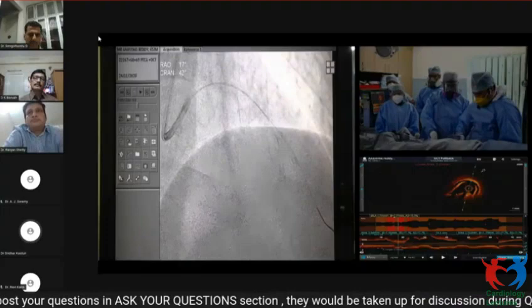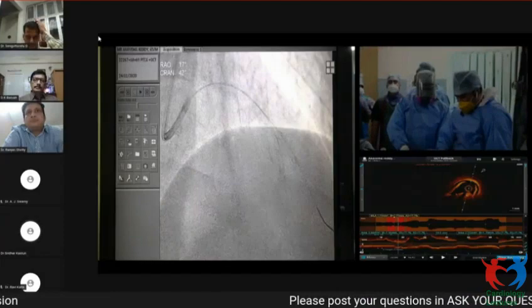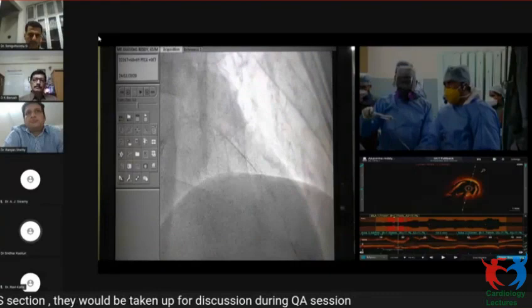Not only the regular, even any stent also, better to give 20 to 30 seconds, better to give at least 2 inflations so that the stent gets apposed very well. Expansion and apposition will be, particularly after these IVUS studies, bigger the better. Better to go with high pressure and keep it there for 20 to 30 seconds, if the patient is tolerating well.